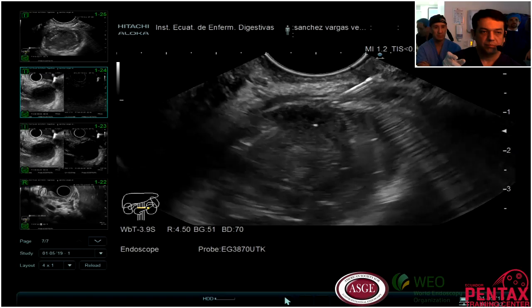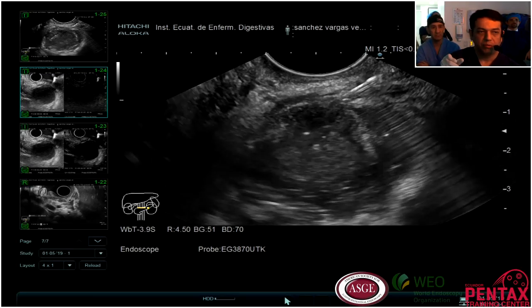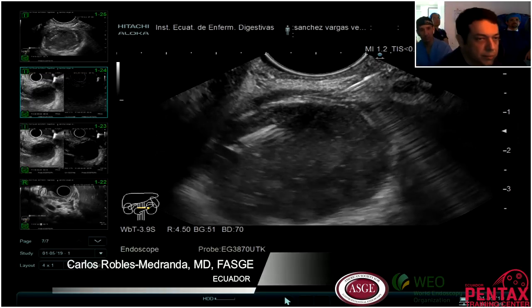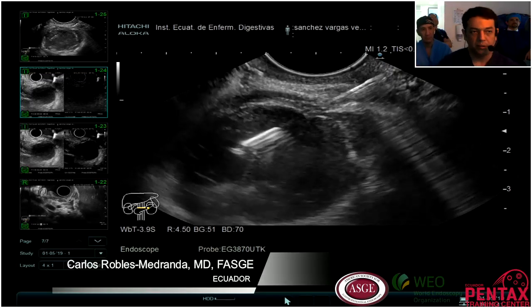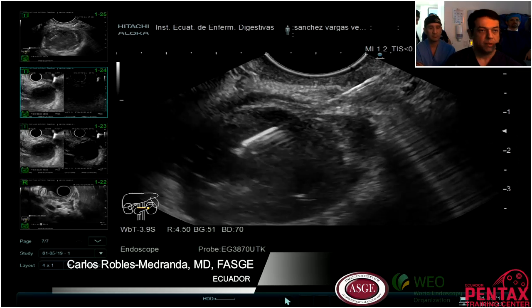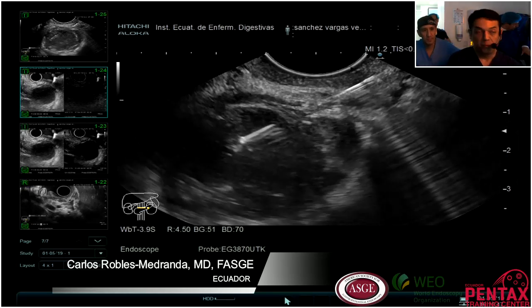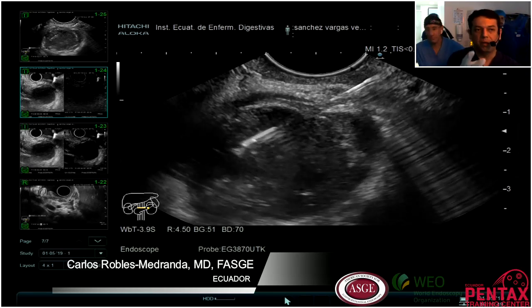So now we are very well. I will use a guide wire just to be sure. Normally it's not necessary, but I prefer to avoid a complication now.